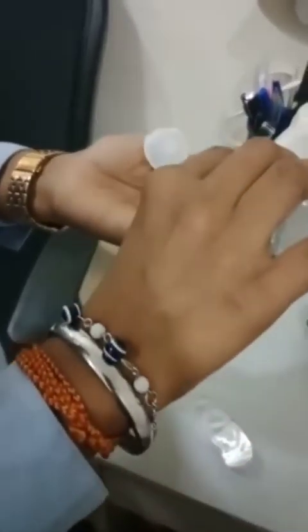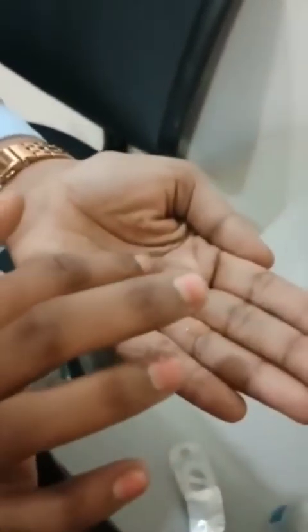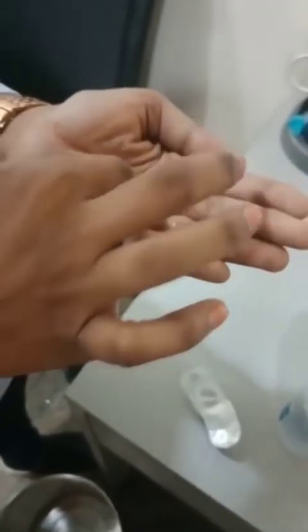After washing the hands, always clean the lenses before insertion and after removal. Take the lenses on your palm, take 2-3 drops of solution on the lenses and clean the lens gently with your index finger in an up and down position for a few seconds.